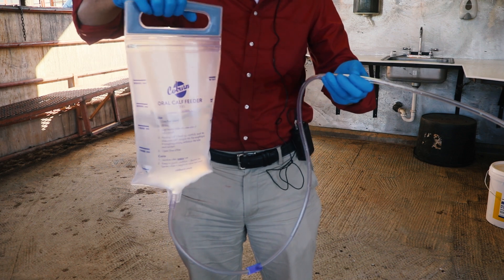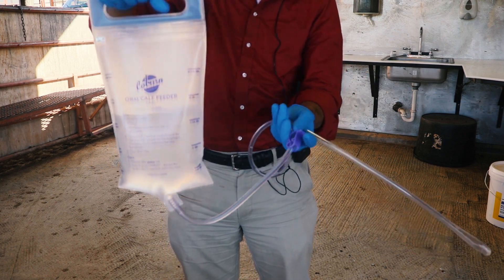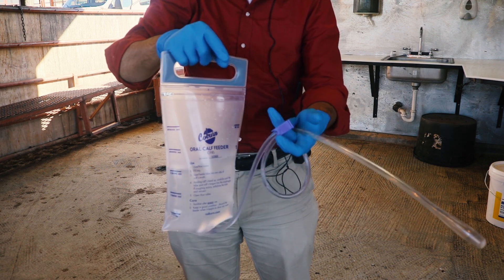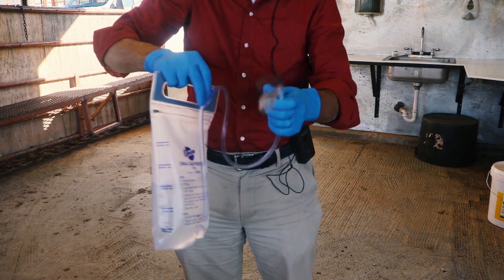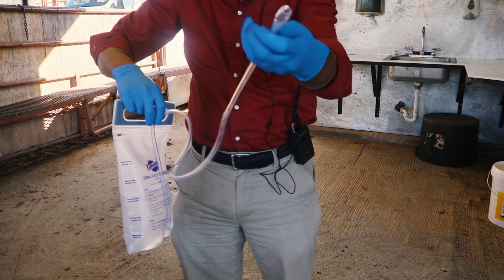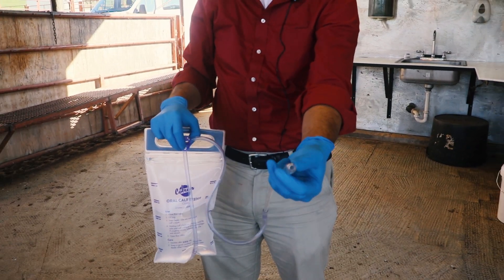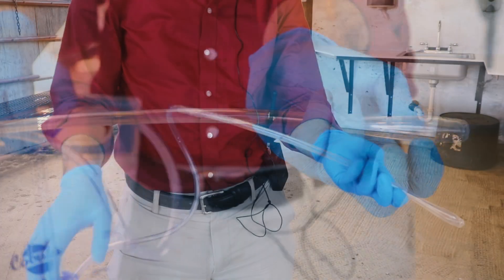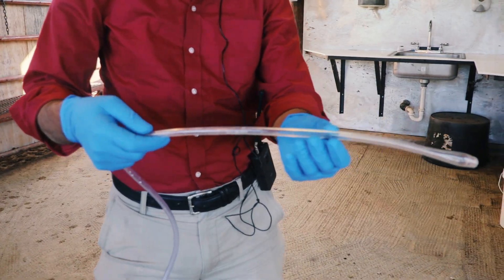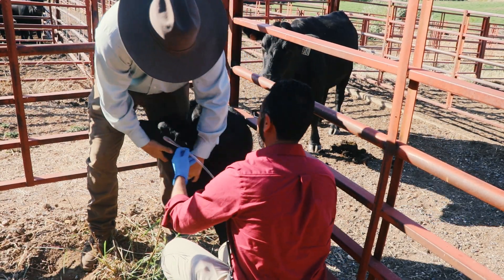Esophageal feeders have a rigid tube that is inserted into the calf's mouth, a bag for fluids, and they may have a clamp, such as seen here, that allows you to stop the flow of fluids into the tube. There is a bulb that helps to guide the tube into the esophagus rather than the trachea windpipe. Make sure you check the rigid part of the tube for sharp edges that could cause injury to the soft tissues of the calf.